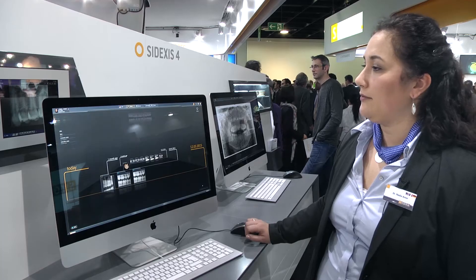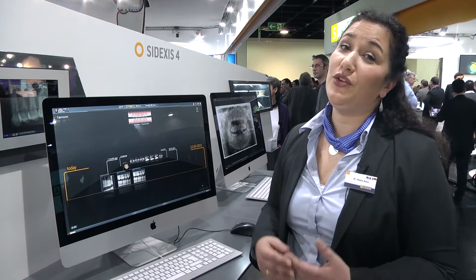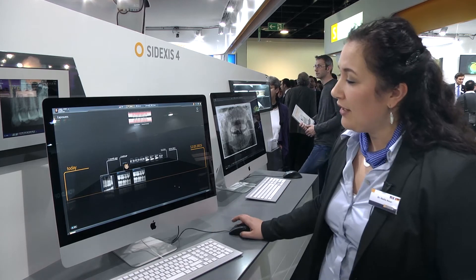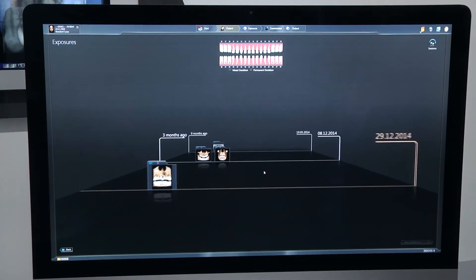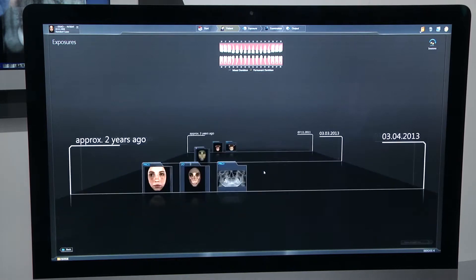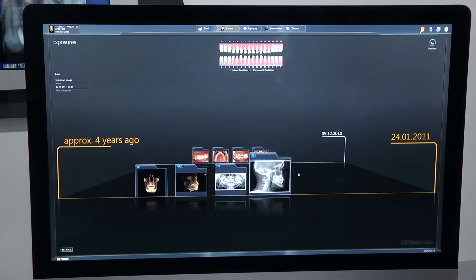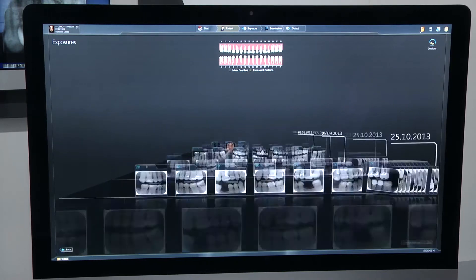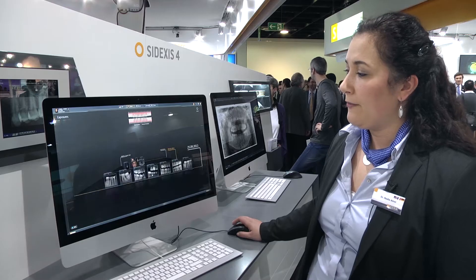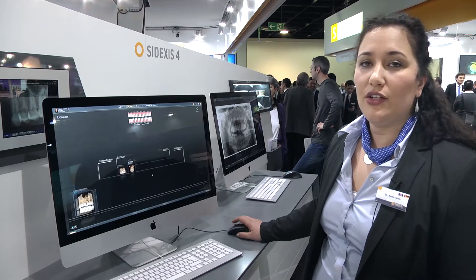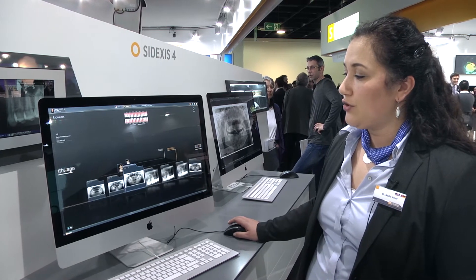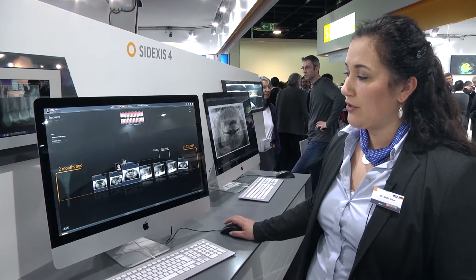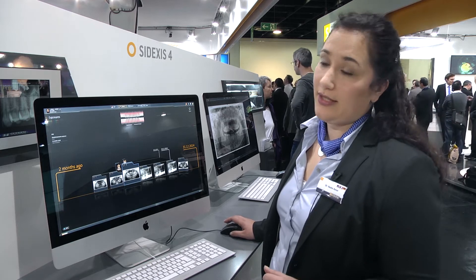If I click here, that brings me to one of the newest and coolest features in our software: our timeline. In the timeline you see all the images of the patient in a chronological order, so you can scroll through the entire patient treatment history. No longer searching for the right images — and it doesn't matter if it's an intraoral or a pan image, they're all there at one glance.